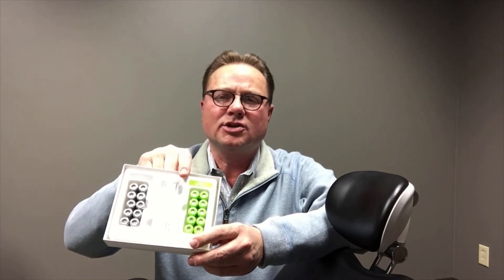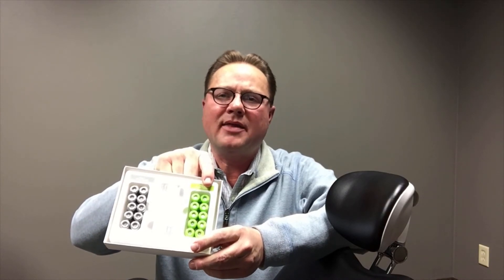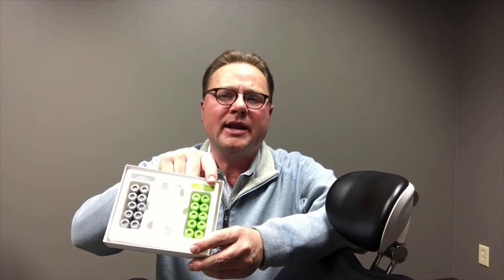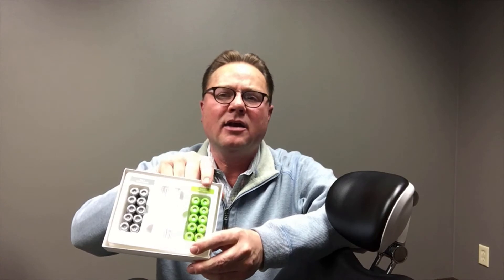Once that 90 seconds has been concluded, you'll take a second brush and pierce the potassium iodide unidose and apply that in copious amounts for 90 seconds. As you apply and agitate the silver diamine fluoride product, it will eventually start to transition because of the potassium iodide from that silver grayish color to eventually become a light white and eventually clear.